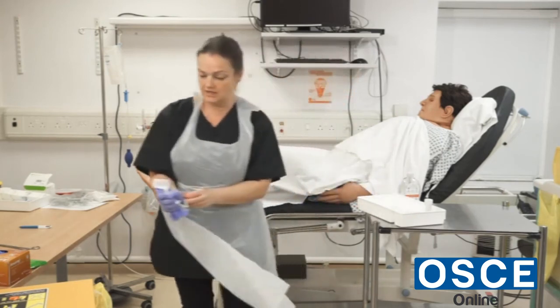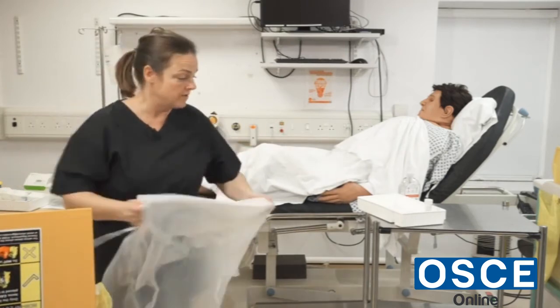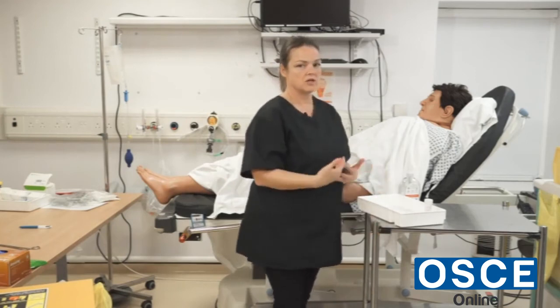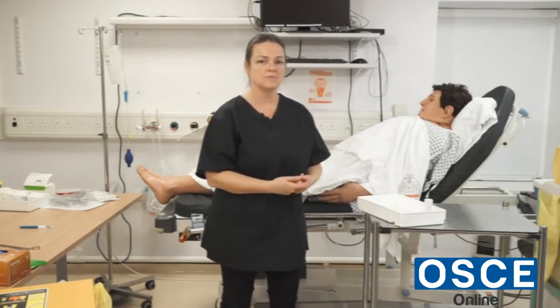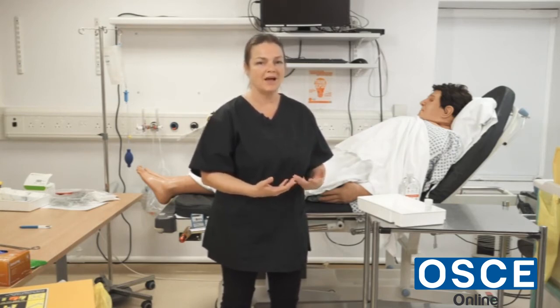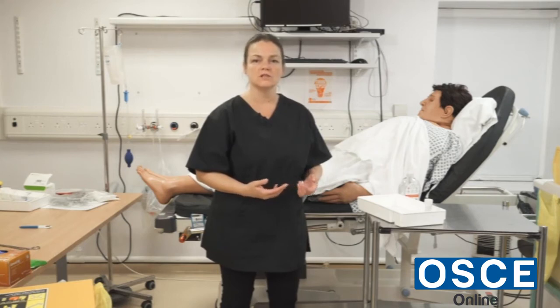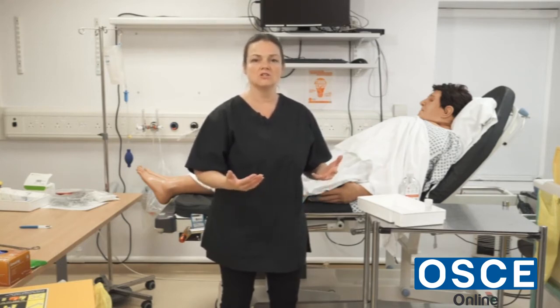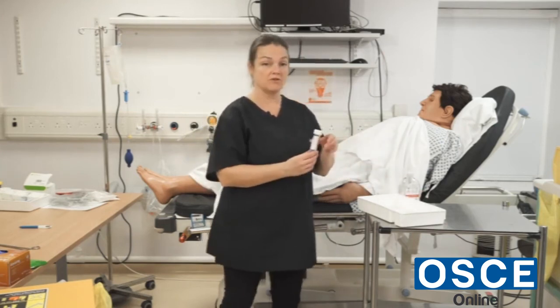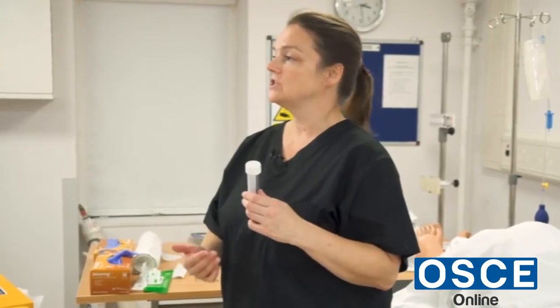Take the gloves off — any rubbish out of the tray can go in the clinical waste with the gloves and the apron as well. I would advise the patient to drink plenty of water — two to three liters is advisable. Light exercise is good when you have a catheter in. Any signs of urine infection would be pain, discolored urine; if severe, feeling unwell, shivery, nauseous, unusual discharge, or pain — just let us know. The sample will be sent to the laboratory and the doctor will inform the patient of any changes in treatment.